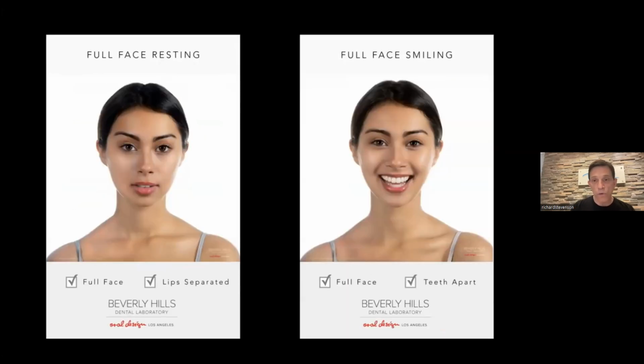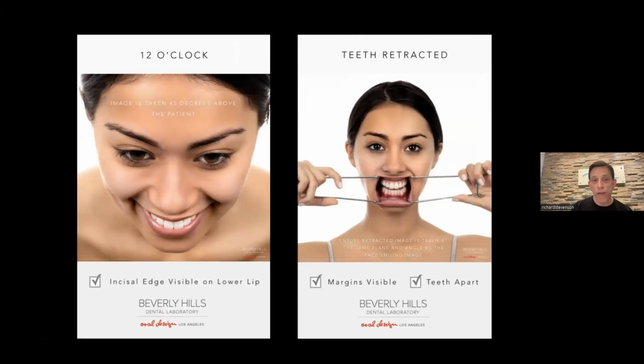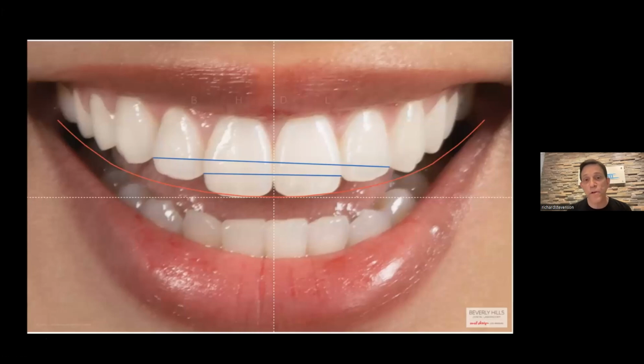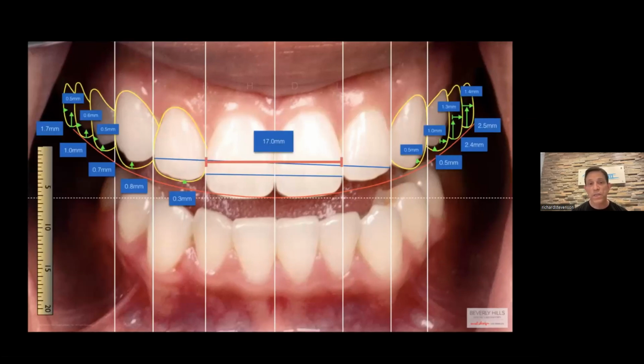And what they'll do is they'll give you back a digital smile design workup that looks like this. This is what they'll send you back, this photo that provides you with these lines that sort of relate the distal of the lateral to the distal of the lateral. They're just trying to point out, hey, there's an asymmetry here. Where the centrals look really symmetrical and you're like, hey, well, I like asymmetry. That's great. I don't want those blue lines to be parallel. I want them to be a little different. So don't change that very much, or do change that. It just gives you the opportunity to see where they're headed with the case.